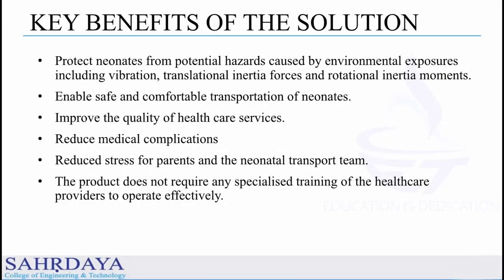The key benefit of the solution is to enable the safe and comfortable transportation of the neonate. It protects the neonate from any potential hazards caused by the environmental exposures, including the vibration, translational inertial forces, and rotational inertial moments, etc. It also helps reduce the neonatal mortality rate and hence helps the country to achieve its Millennium Development Goal of NMR.